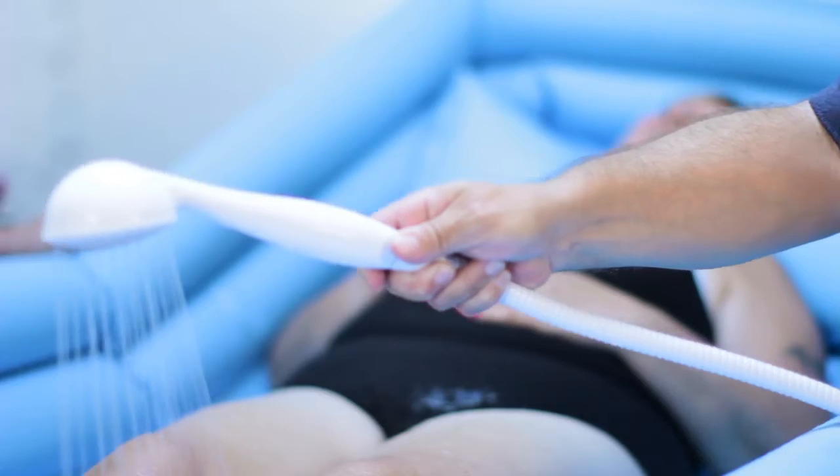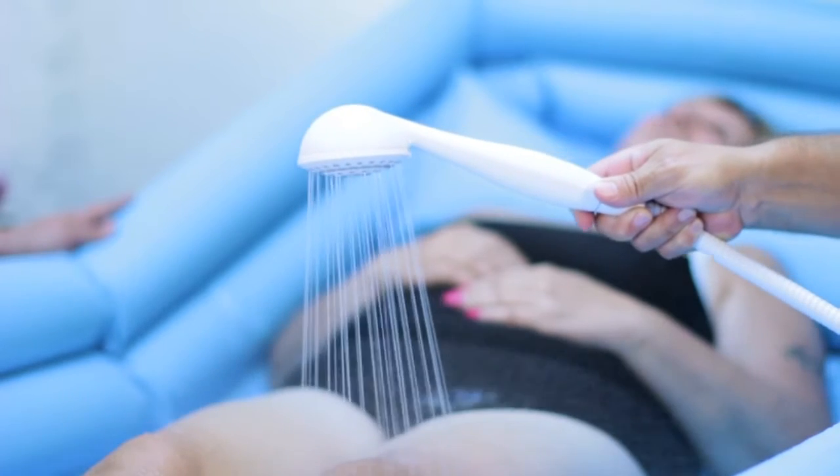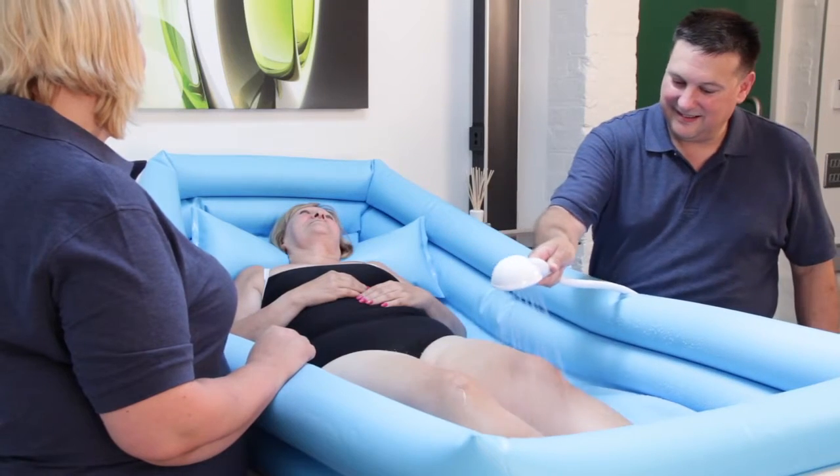Welcome to the Watergenie instruction video. The Watergenie gives the luxury of a real shower in your own bed.